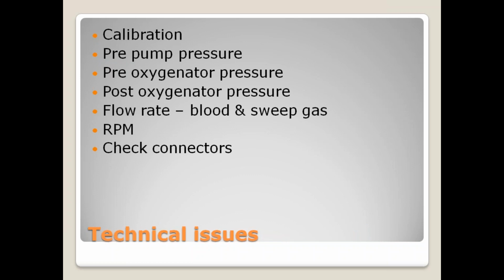So what are the technical issues? There can be something wrong with the calibration of the machines. Pre-pump, pre-oxygenator and post-oxygenator pressures you have to monitor. That will give you most of the information. Your blood flow rate, sweep gas and RPM relations you have to see. And you have to check the connectors. If you look at all these things, you will be able to get most of the answers about the technical issues.